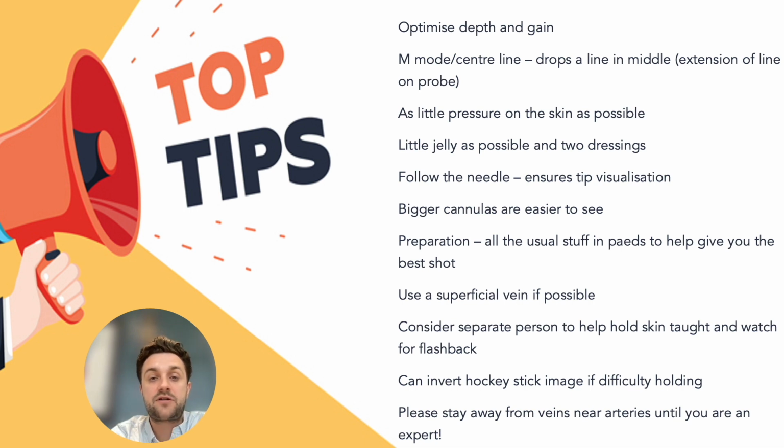A second person to help hold the skin taut for insertion, because you'll have one hand on the probe and one on the needle, and also this person can help look for flashback so that you don't need to take your eyes off the screen. Because if you take your eyes off the screen, you might find it tricky to find that needle again, and you might be back to square one.